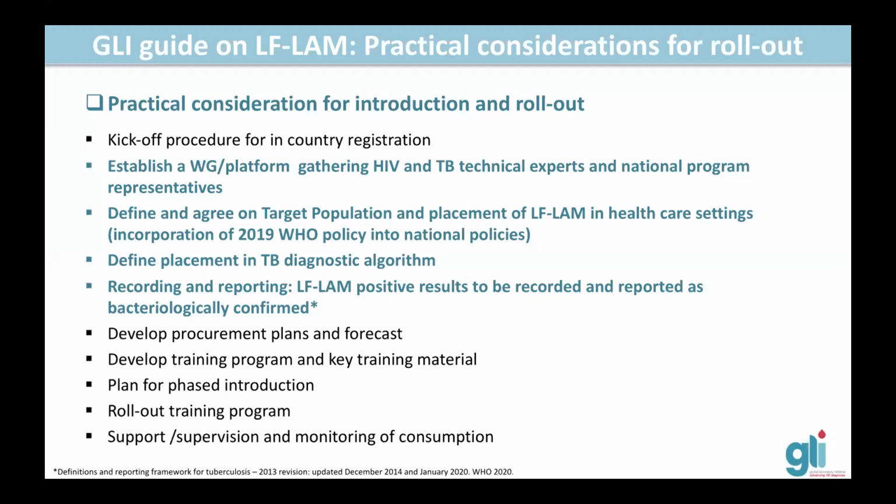And then, very importantly, WHO has decided that the recording and reporting of lateral flow LAM positive results needs to be reported as bacteriologically confirmed. So even if it is a biomarker-based test, still the results of this test need to be recorded and reported as bacteriologically confirmed.